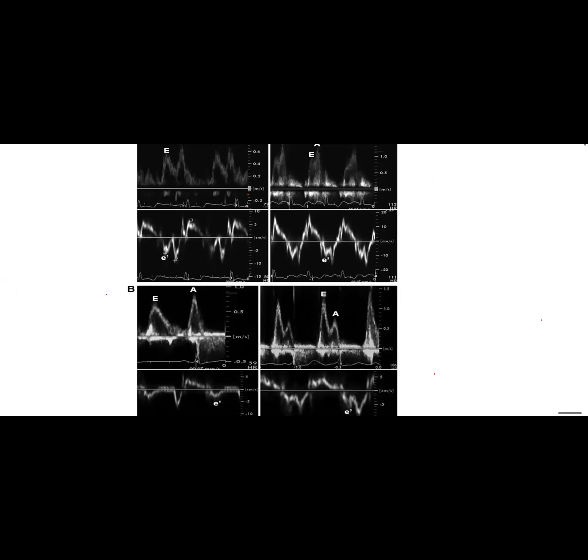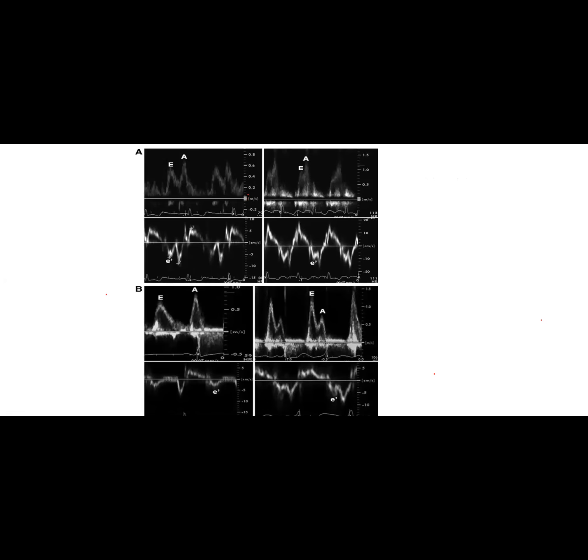And this is the diastolic stress test. Simply, you exercise the patient to the peak, during which you measure the mitral inflow and the E prime. Basically your target is the E/E prime ratio. So if it remains the same, improves, or gets worse, meaning it increases. If it increases, that means I demonstrated elevated LVEDP during exercise, which was not present during rest. Meaning I have demonstrated a low diastolic reserve and the diastolic stress test is positive.